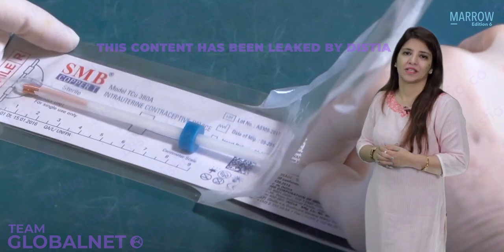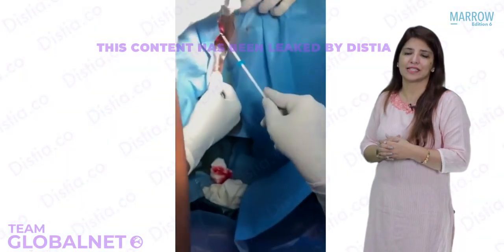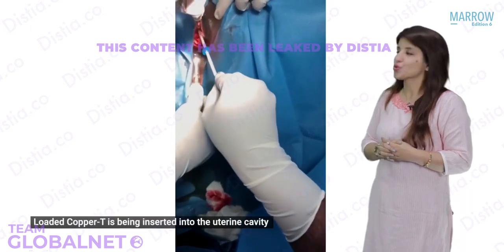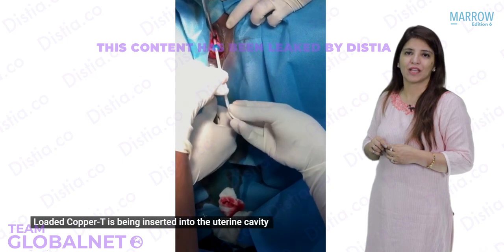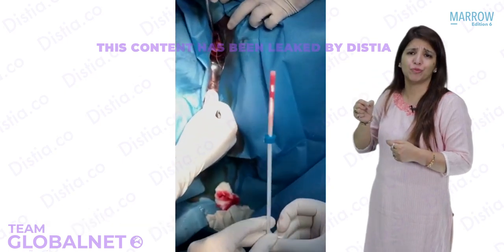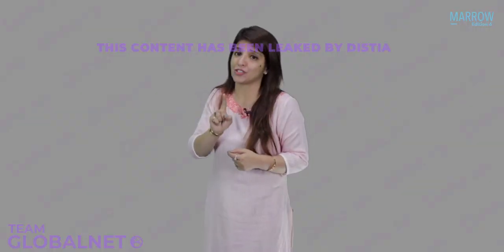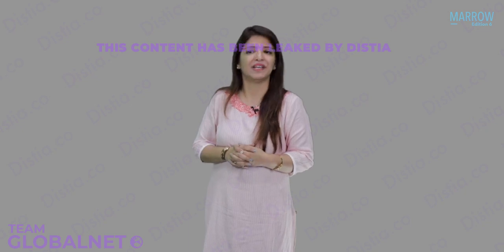So have a look. Now this loaded copper T, I am going to take it inside the uterus so that the blue colored flange lies at the level of the external os. Once it is at the level of the external os, I have just withdrawn the inserter tube and not the plunger initially. Later on, the plunger was also withdrawn and the threads were cut.